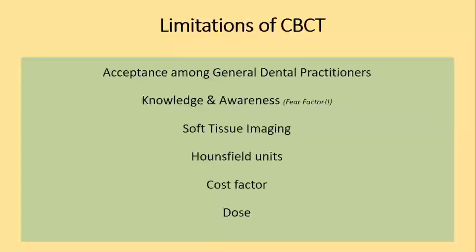Yes, so what's the limitation? I think the biggest limitation is, one, the general dental practitioner just wondering, hey, is it too expensive? Do I need it? Yes, maybe. But over the years, I've seen they're not really as expensive as you want it to be. But the information you get from CBCT is much more than any 2D imaging. And how would all that translate to better patient care?